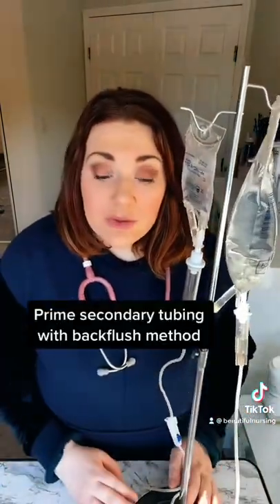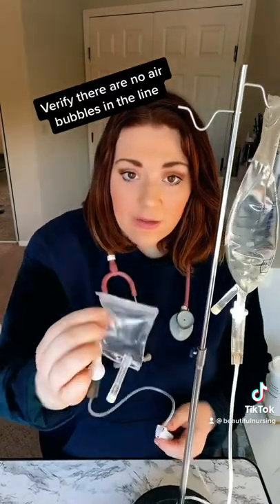We're going to do the back flush method to prime the secondary tubing. We're going to grab this down, open our roller clamp, and wait until we see it bubble — which we already see it bubbling.